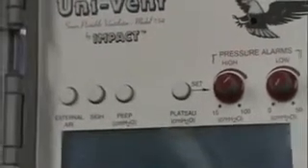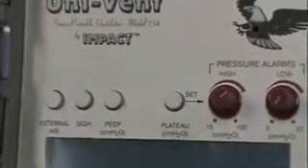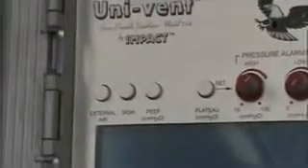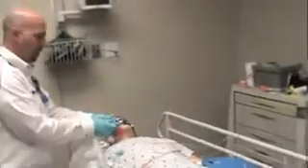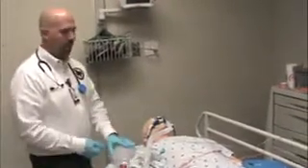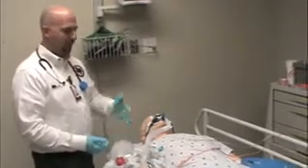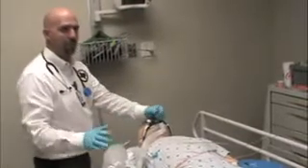And one common mistake that people make is they'll set PEEP on the ventilator and then they'll break the circuit several times over. So if I've had the patient attached, I'm going to move here to a real lung, so let me have some alarms here for a minute. I move the patient over to here, and I decide that I want a bag, or I want a suction, or I want to do anything that's going to cause me to have to break the circuit. Every time I break the circuit, I lose all the PEEP we just worked to get.